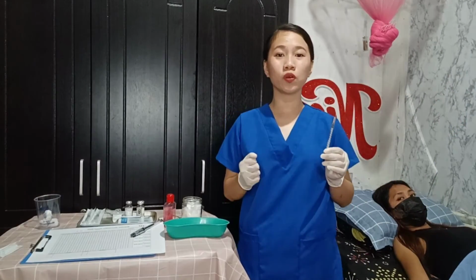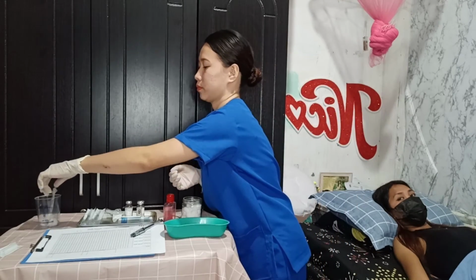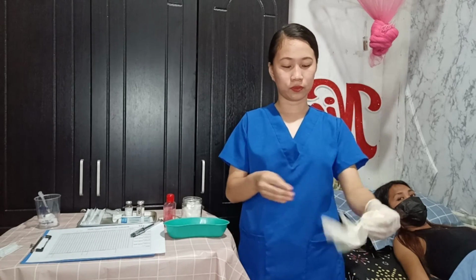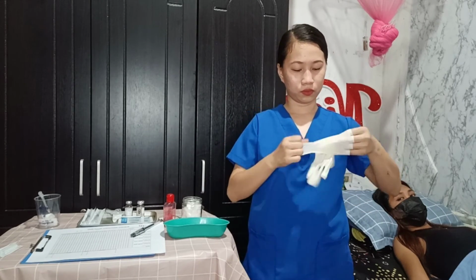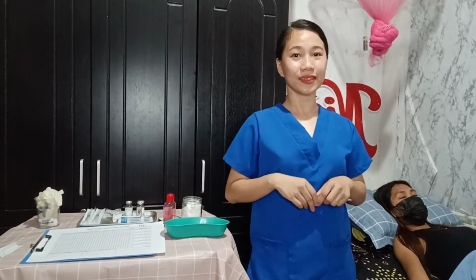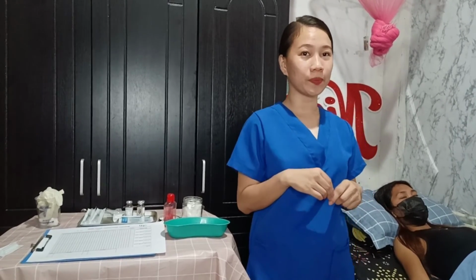Then next, dispose of the syringe and the needle in the sharps container. Remove your gloves. Next, circle and indicate the time and the injection site with ink to observe for redness or induration per agency policy.